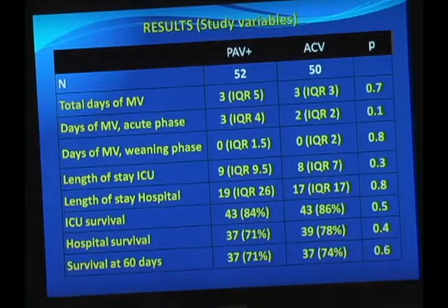Any explanation? Can you suggest some? Can you help us understand why it was so? Well, you did not confirm your first hypothesis. With a negative trial, we could not demonstrate that it was better than the control, but we can show that it was at least as comparable as controlled mechanical ventilation.